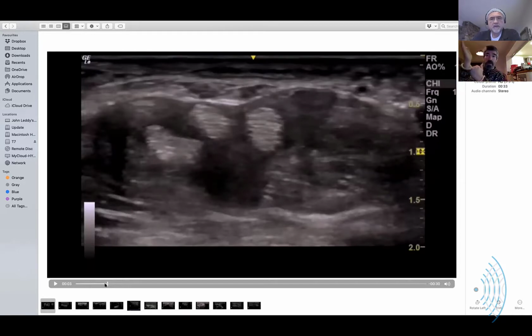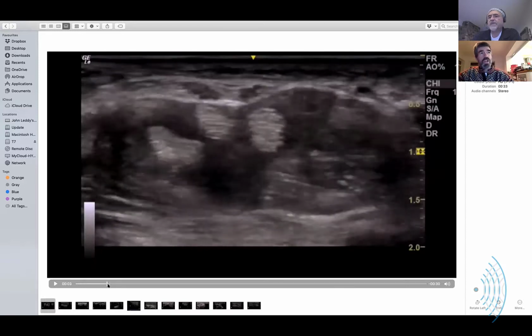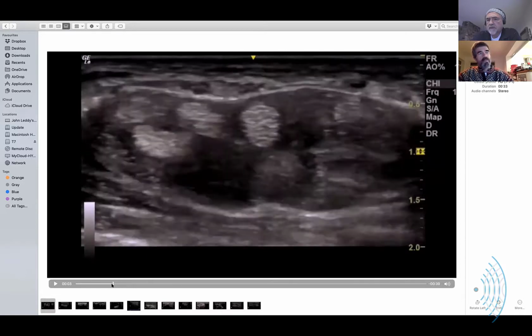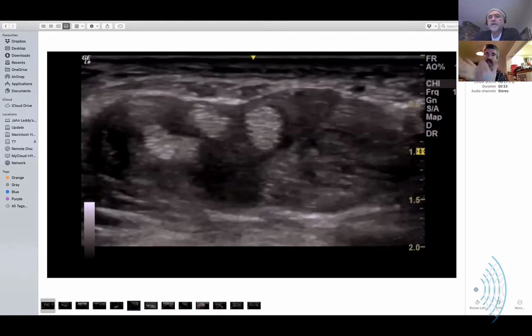proximal to the wrist. And so then these are the contractile components of the flexor tendon muscle that's growing toward the carpal tunnel. No. That's what my eye sees when I first go over there. I see these as the tendons and this is the muscle. Yeah. But that's what you would see if you were here. Yes. But when you are in the hand, which is where we are now, this is synovitis.